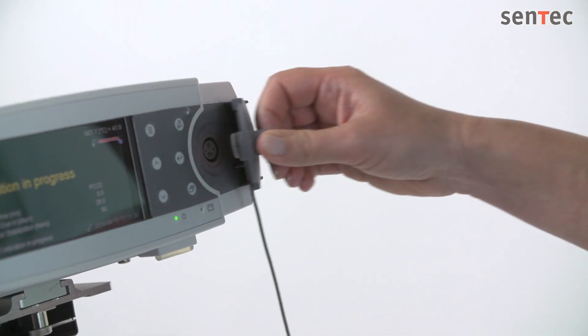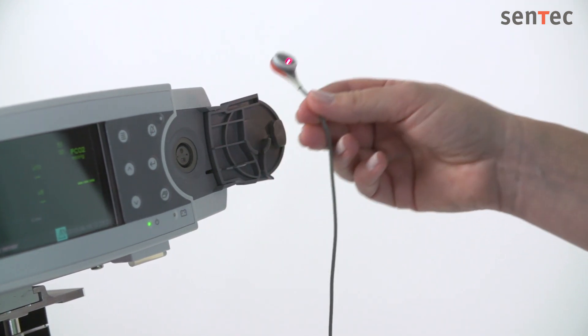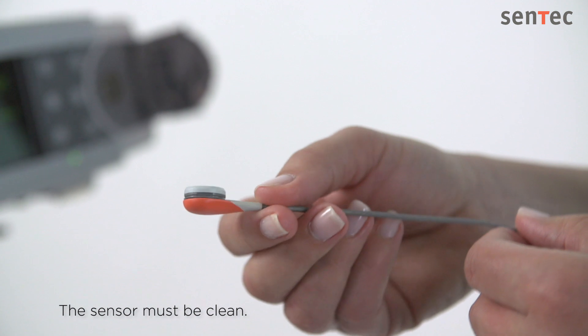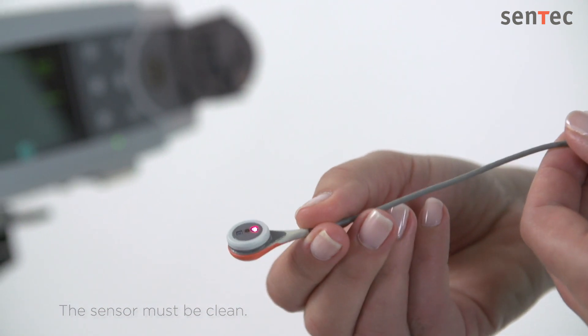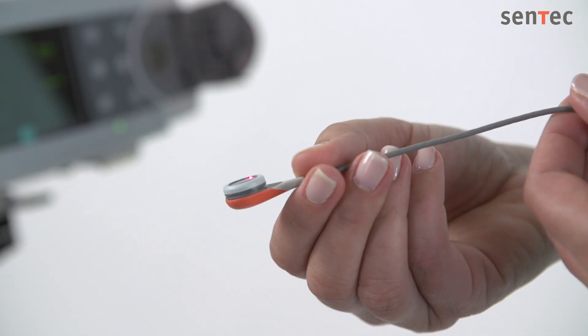Ensure that the sensor is clean before changing the membrane. Carefully wipe off any residue from the sensor's surface using 70% isopropanol or another approved cleaning agent. If necessary, soak the membrane sensor in clean tap water before cleaning to loosen dried-up contact gel. A clean sensor is essential for a successful membrane change.